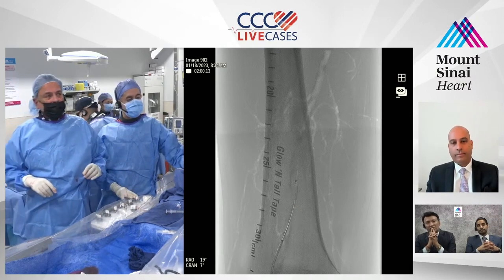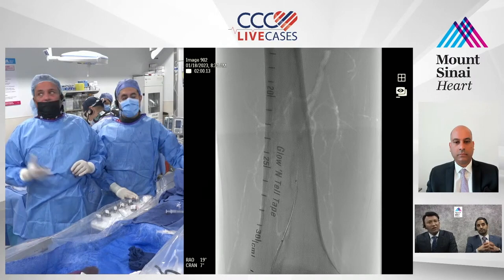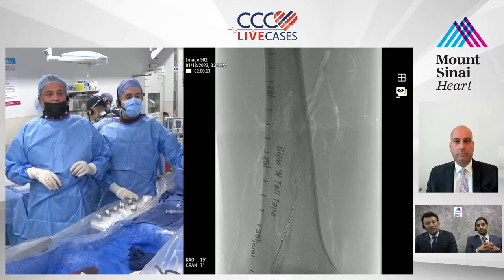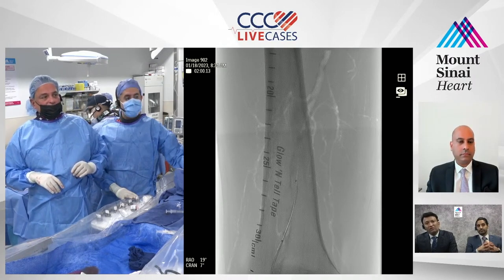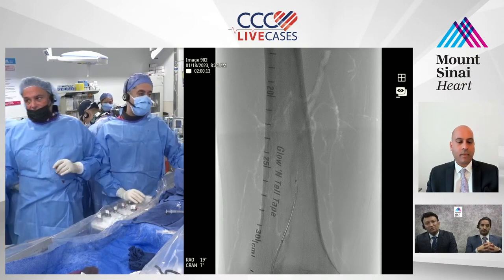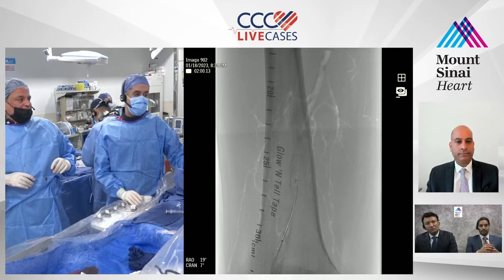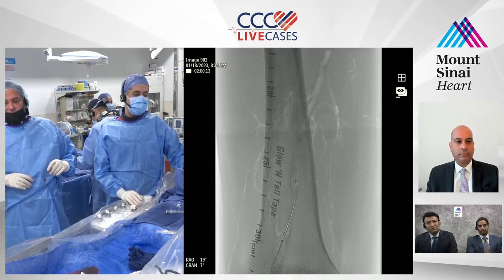PK, any hesitation, any reason why you're hesitating to use just a reentry device? We have time. I mean, I think what I'm going to do is try once or twice with two different wires, the way Srini and Ajit suggested. And then Srini, Ajit's already suggesting to go with a 035. Can you just give me an 035 Glide while you look for the Connect 250T? And then we're just going to go ahead and do it.